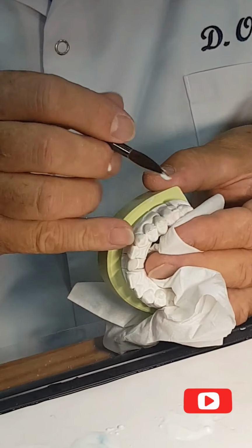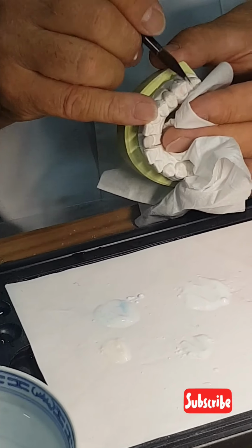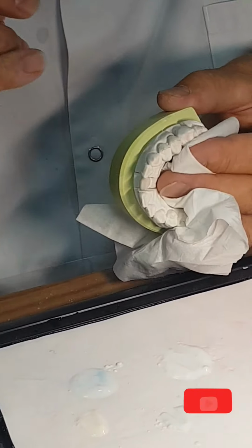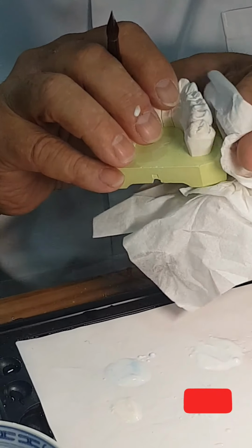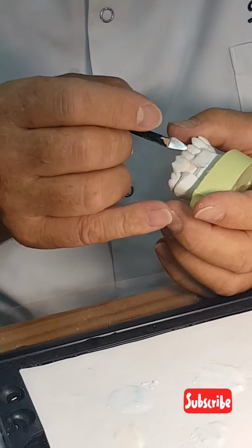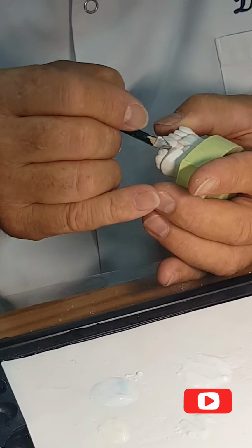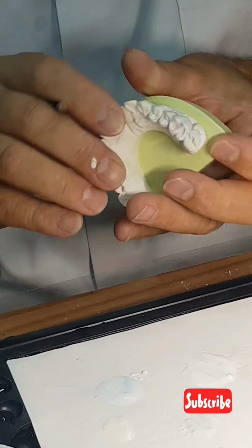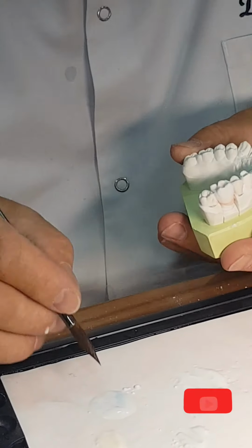And I overbuild 10%, I already explained, 10% over. I have a specific technique I will explain to you during the afternoon for the bridge about the shrinkage, because the bridge gives us a lot of problems with the shrinkage. We have the feeling of being obliged to fire one time, two times. No, it's not necessary. I will explain to you why.